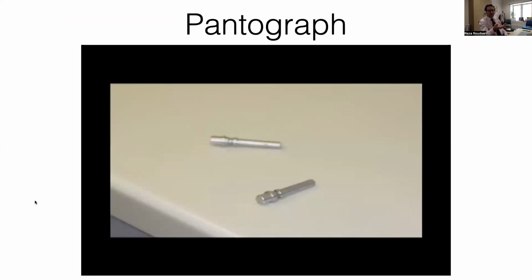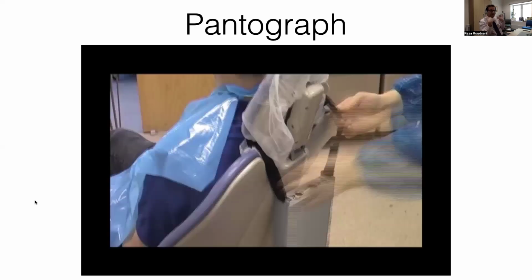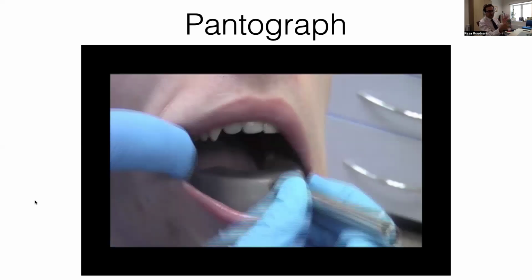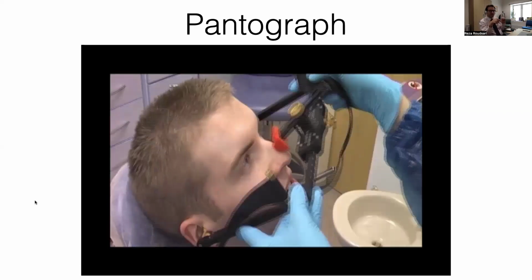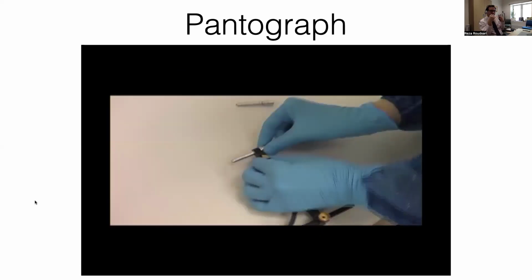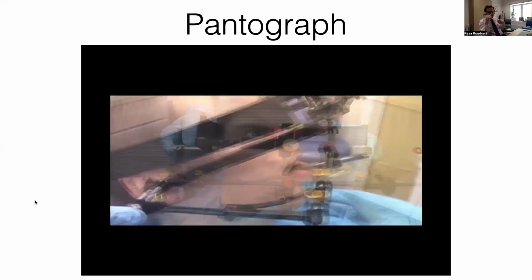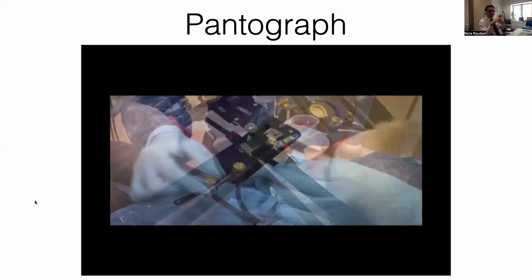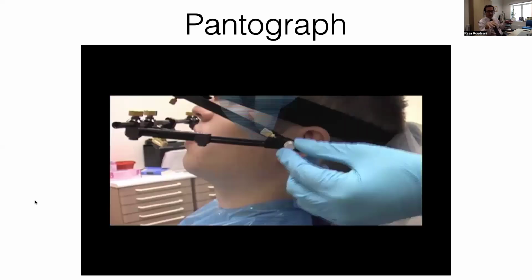So essentially with your pantograph, you do have a Facebow which goes to your maxilla, and you've got a Facebow which goes to your mandible. So you've got this computer, which goes behind the patient chair, and then you've got your apparatus, whereby you put it on the patient's top jaw initially, and then the mandibular bit. As you could see, there was a clutch which you fill in with a registration paste. It goes over the patient's mouth, and you do your mandibular Facebow.